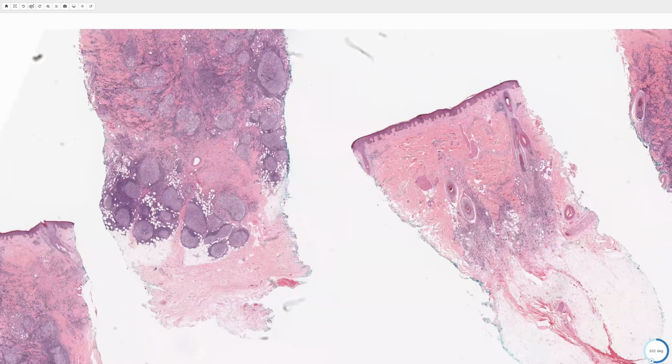You can see that we have these bigger cells at the center, which are composed of centrocytes and centroblasts or immunoblasts. The centrocytes have cleaved nuclei, which have a coffee bean architecture, and the centroblasts have more open chromatin and a stippled configuration. At the periphery, we have these smaller lymphocytes that are more monotonous in appearance. Those are the marginal zone and the mantle zone. And usually in this area, you can also see some eosinophils and some plasma cells, an admixture of cells.